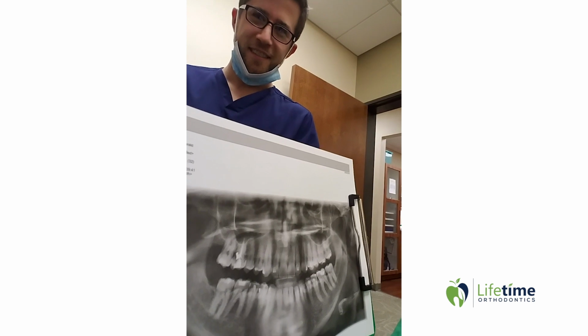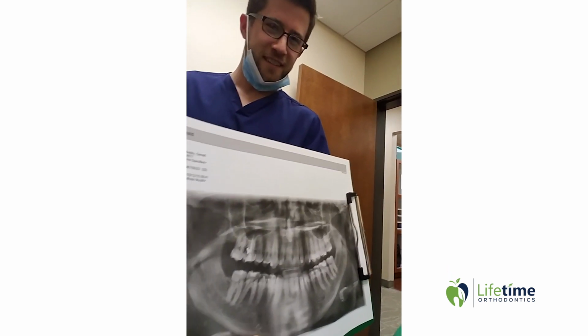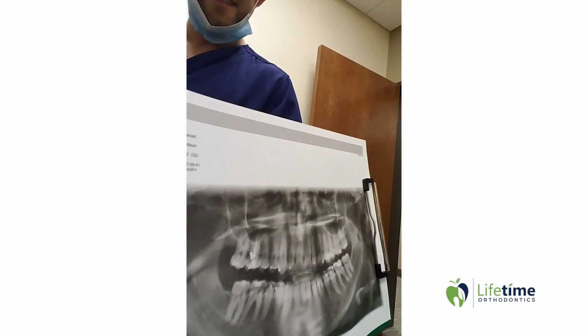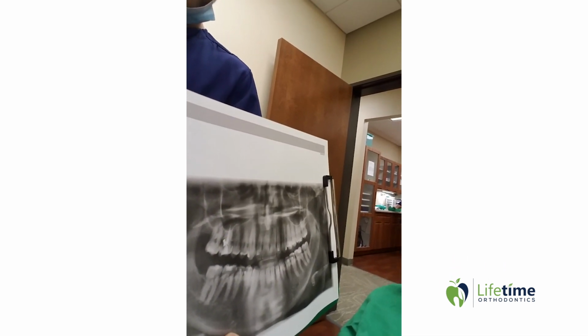It's kind of funny that I'm here in this office because Dr. Joe Hildebrand, his partner, did the apicoectomy. Apicoectomy is when we section that root off, so you can see where that dark spot is right there. That was kind of backfilled with where that root used to be.